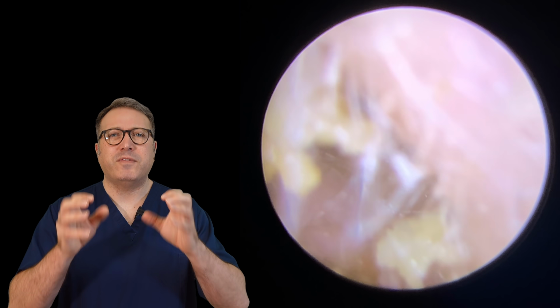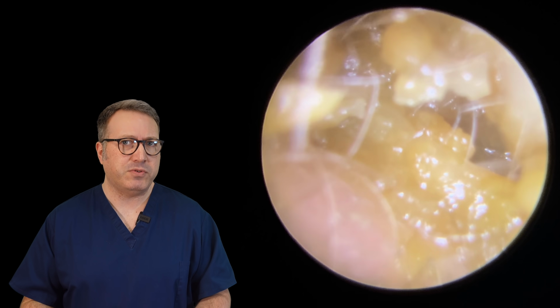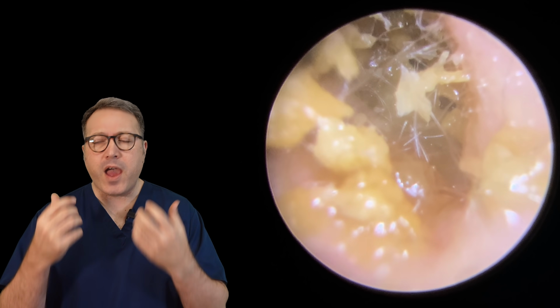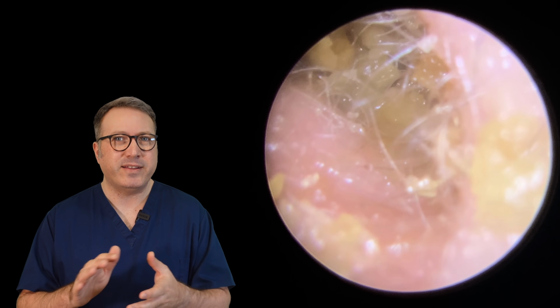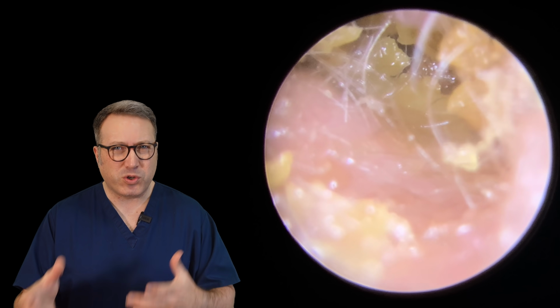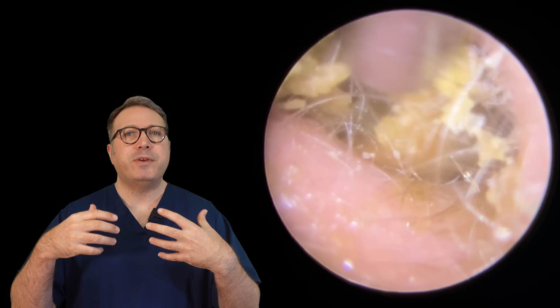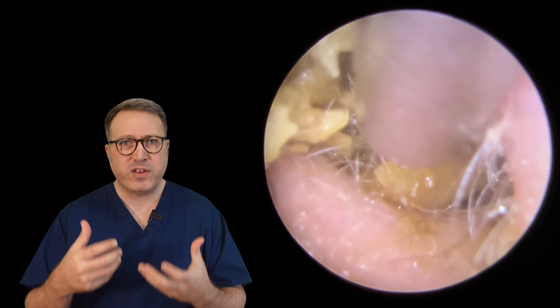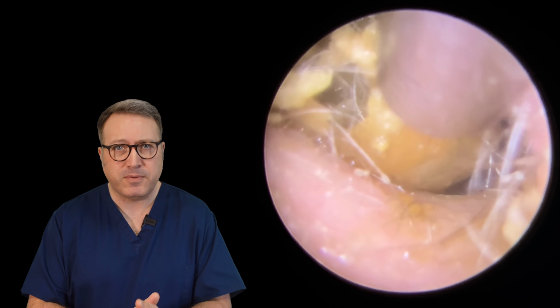Oh, this patient was lovely. So basically, this patient's come through with very, very dry skin issues. This patient was very nervous coming into clinic. Never had their ears cleaned out by suction before. Didn't really know what to expect. Always been used to having it done by the GP. But what's happened here? The patient's been experiencing a lot of hearing issues, having real difficulty communicating with friends and carers and other bits and pieces.